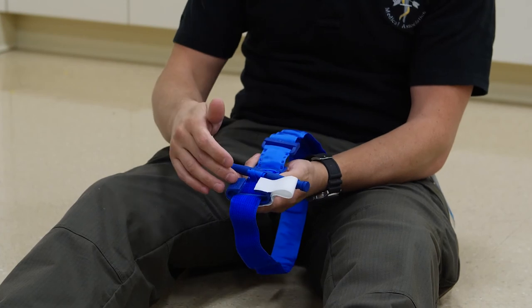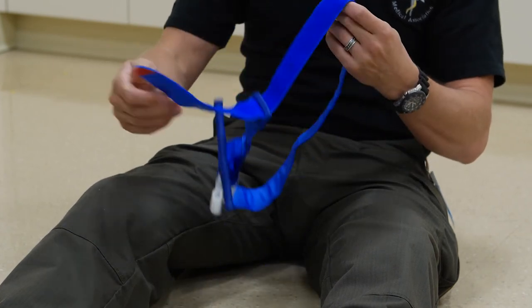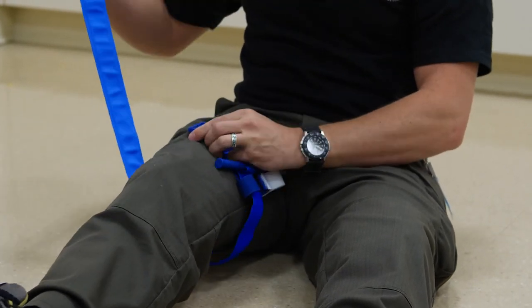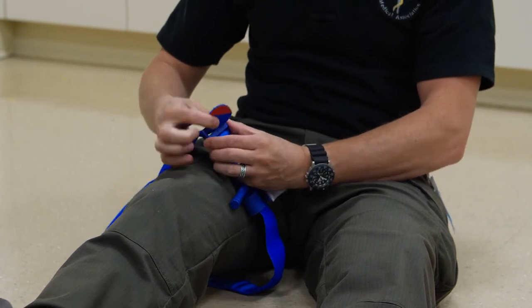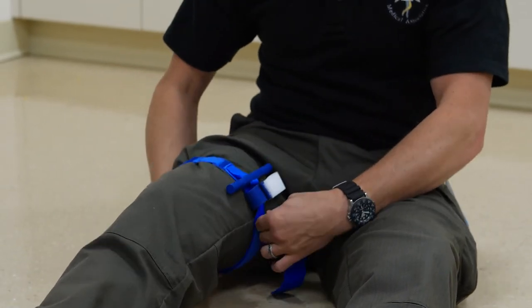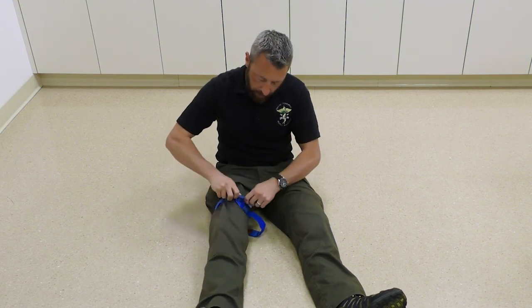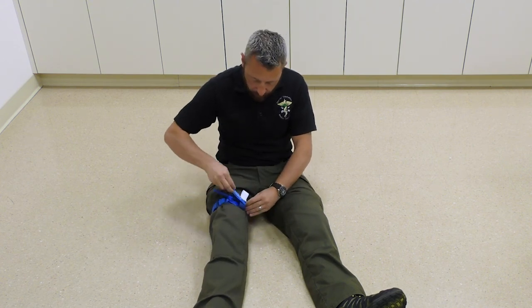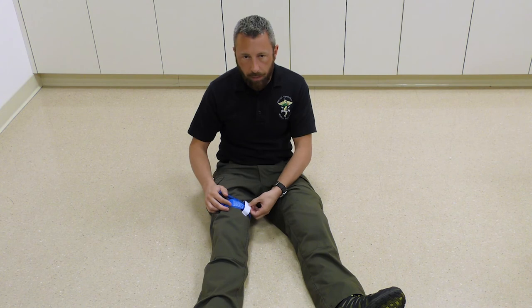For the CAT Gen 7 leg application, take the tourniquet apart, go around the leg and through the single buckle hole — there is no second opening on this tourniquet. Pull it as tight as you can, bring it back three-quarters of the way around, access the windlass, pull up and spin until the bleeding stops. Lock it in place inside one of the ears, pull the excess through, put the time piece across the top, and mark the time.